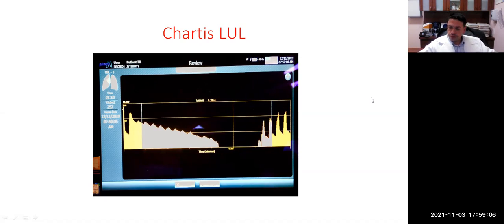Did you say that there are some where they look visually as if they are fully intact, but then when you do this test, you'll find that yes, there is collateral? Yes, yes. Well, I have had patients with 100% fissure who could not get a procedure. Interesting. And at the same token, I had one guy with 80% fissure, and I said to him, don't even bother. This is not going to work.